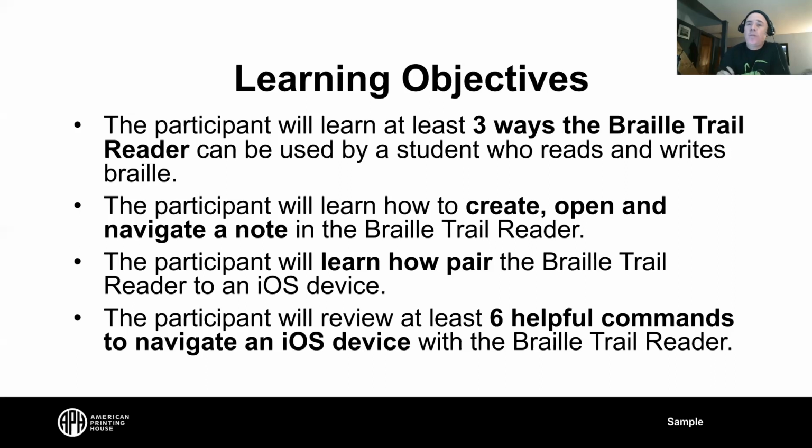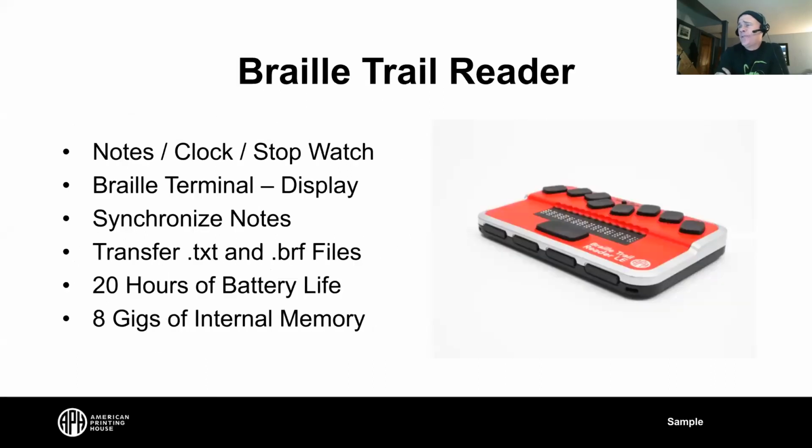All right, so what is the Braille Trail Reader? The Braille Trail Reader is a tool that you can use to take notes.